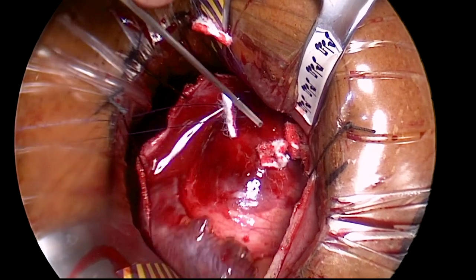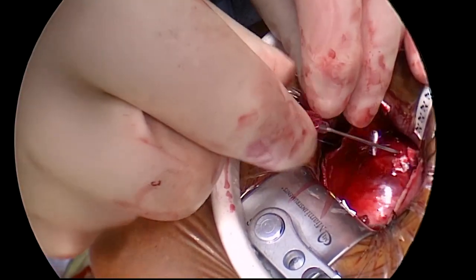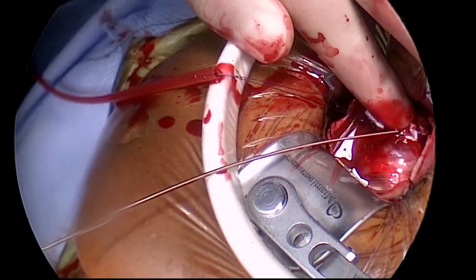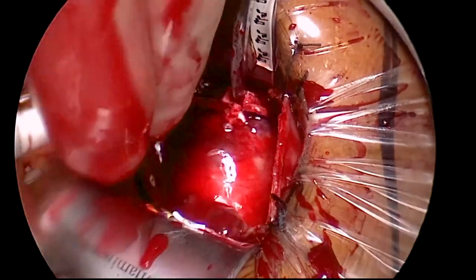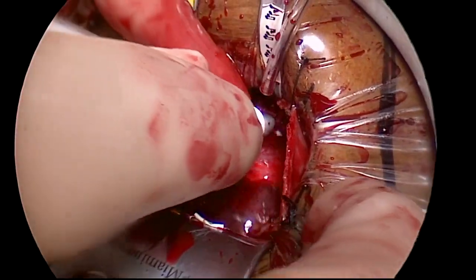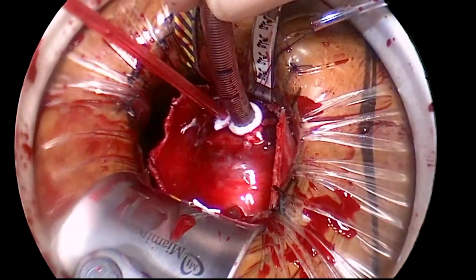The patient is now heparinized, and it is our preference to perform central aortic cannulation over a wire. The position of the wire is confirmed to be in the descending thoracic aorta by the anesthesiologist using transesophageal echo. A 22 French Medtronic eOpa cannula was then inserted over the wire and secured in place.